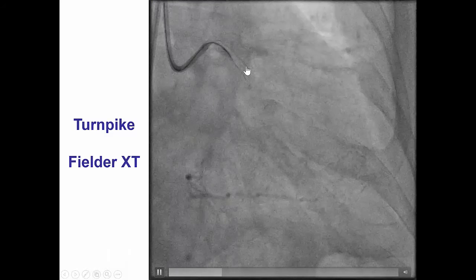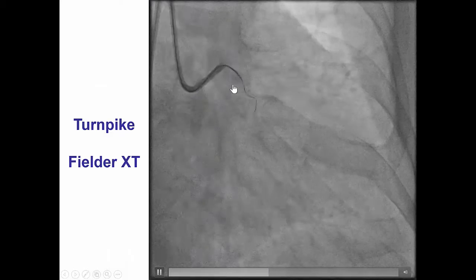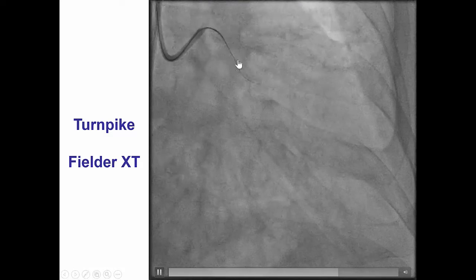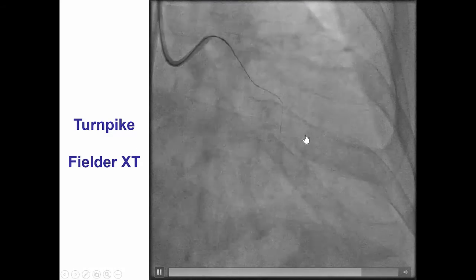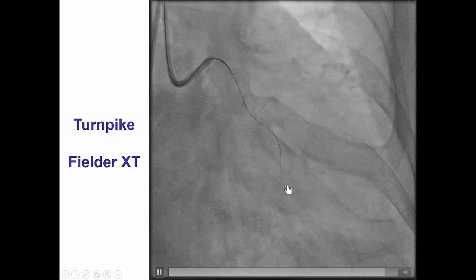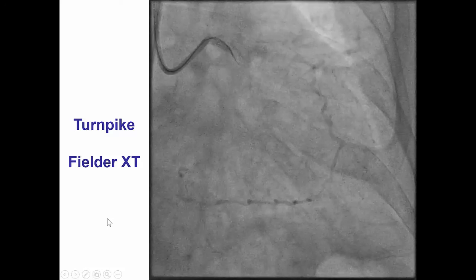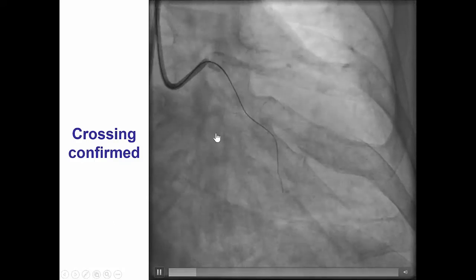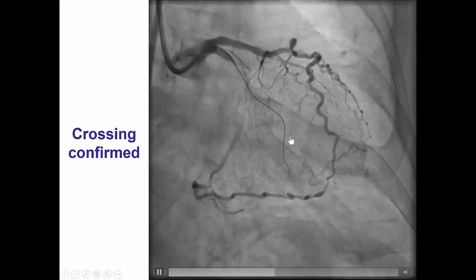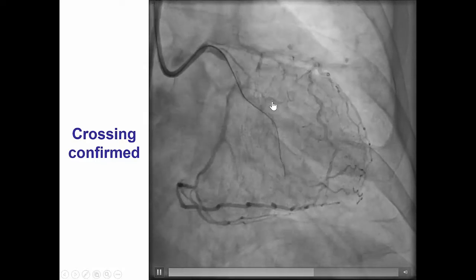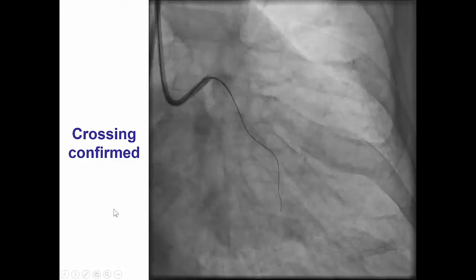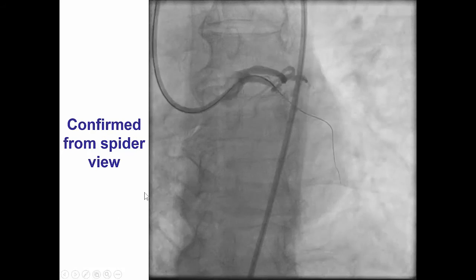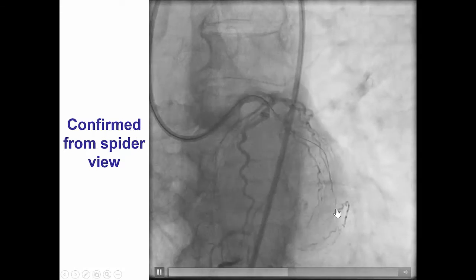A Turnpike catheter was advanced to the proximal cap, and a Fielder XT guidewire fairly easily crossed into the large obtuse marginal branch. This was confirmed by performing cineangiography on different projections — it is in the first obtuse marginal branch, and the same is confirmed on the spider view.